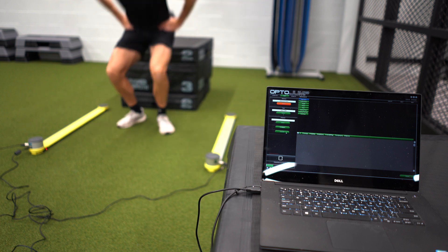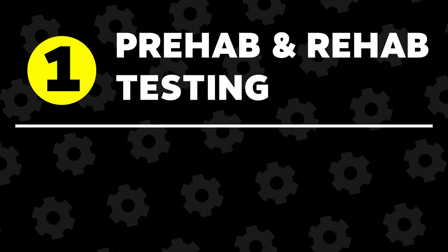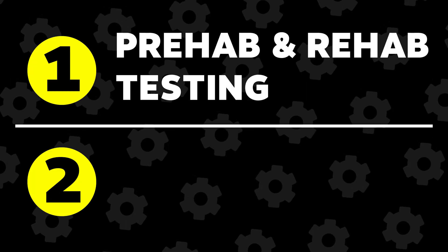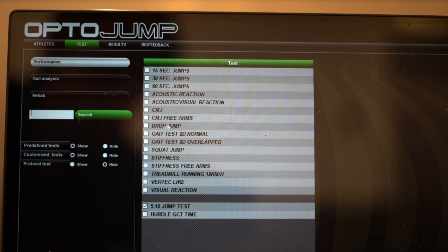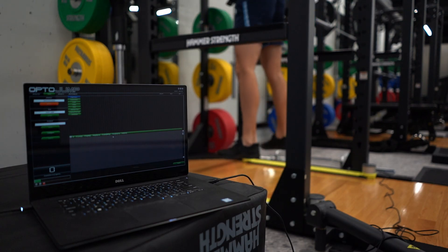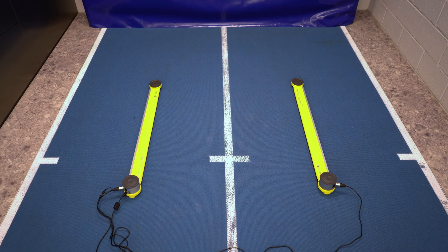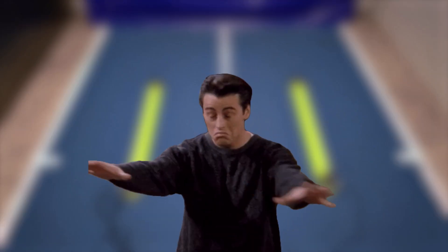The OptoJump is a testing tool and the parameters it can measure can be divided into two categories: one being prehab and rehab tests, and two being the performance tests — with the performance tests of course being the most important one for coaches like us. Before we go over all the performance tests, it's important to know how the measurements get taken so you can account for the blind spots of this tool.